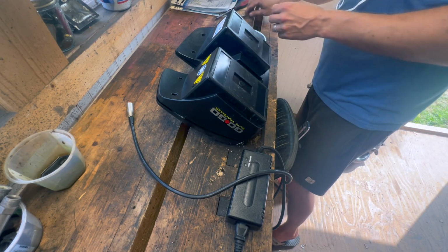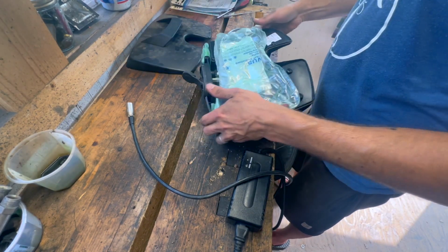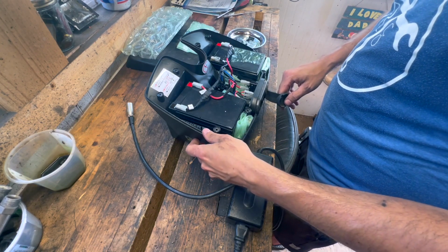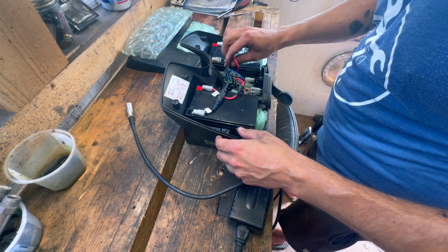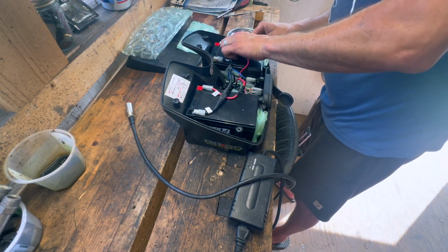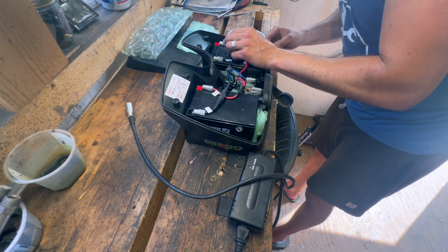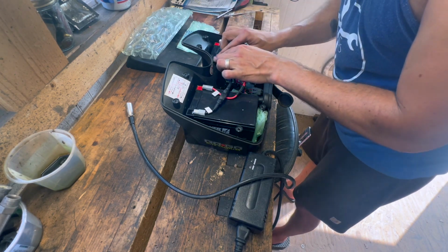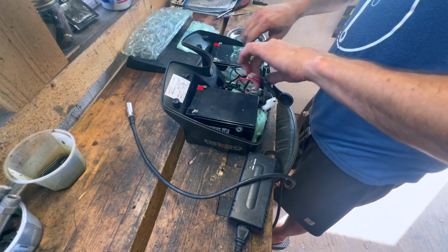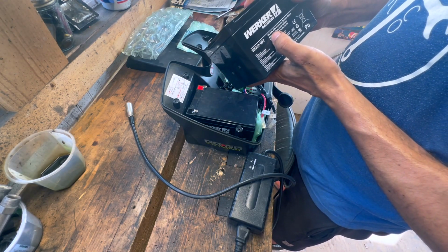Alright, that's all the screws. Okay. I think these are just 6-volt batteries. I'd like to disconnect them first. See, that one's all cruddy. I guess they just sit loosely in here, so that's why it's flopping around. Now it's a 12-volt.